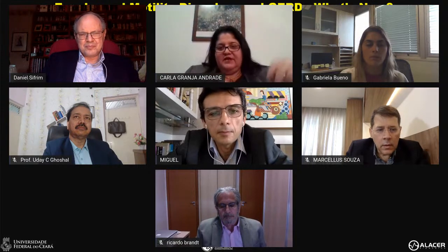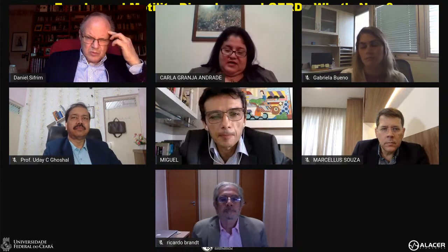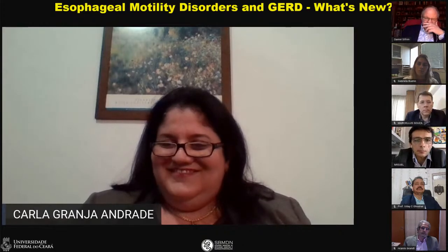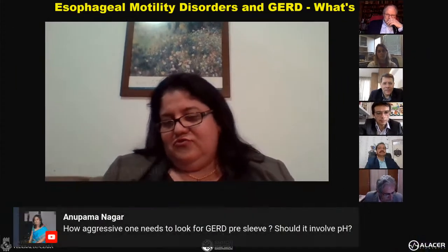Marcelo, can I say something about Miguel's case? This case is very interesting. It's fragmented peristalsis by the Chicago classification, and we don't know what fragmented peristalsis means. And the question is exactly this: is this fragmented by a problem in the proximal or in the mid esophagus? So it's a challenge to help this patient. What do you think to do to solve the dysphagia of this patient, or suggest?